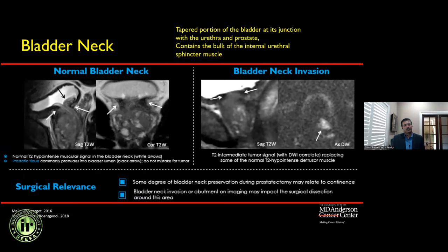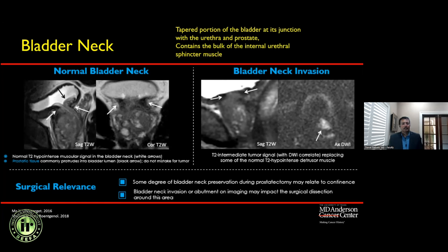The bladder neck is a critical structure that can be difficult to assess on imaging — there are no clear tissue planes between the prostate and bladder, making bladder neck involvement difficult to identify prospectively, especially when subtle. The normal bladder wall shows T2 hypointense signal, and the gland extends into the bladder neck region. Discontinuity of the bladder wall and abnormal tumor signal at the base extending into the bladder neck are signs of bladder neck involvement. Reporting this helps surgeons avoid positive surgical margins.